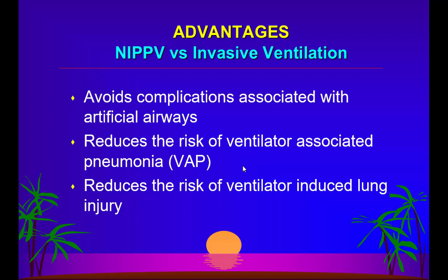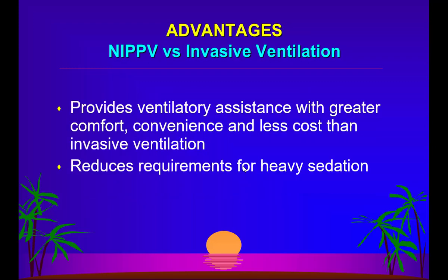So please do not drag these patients on non-invasive ventilation, especially patients of ARDS that I am talking to you. Because it causes more stretching of the lungs and more lung injury. So appropriate timing has to be there. If the non-invasive ventilation, particularly in patients of ARDS, is failing, or the patient is not improving over a sufficient period of time, they should be intubated and ventilated early rather than dragging on the non-invasive ventilation.